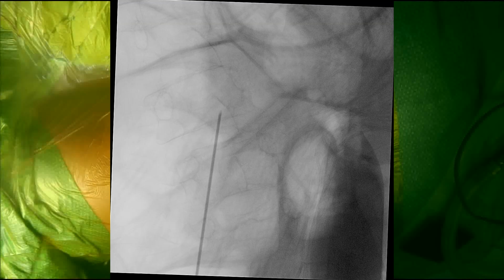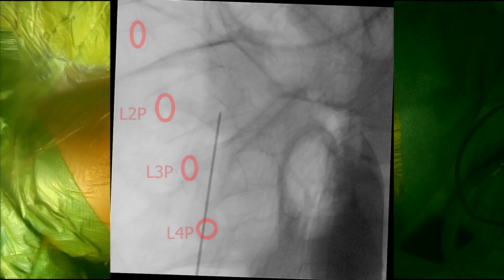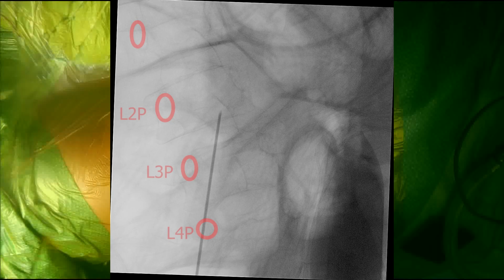As you can see, your entry into the skin would be over the L4 pedicle, and you would advance your spinal needle towards the midline. Your needle will enter the intrathecal space between the L2 and L3 vertebra. And you can see here in your fluoroscopic images how the needle starts out around the L4 pedicle area and advances gradually at a 30-degree angle until you have reached your intrathecal space.